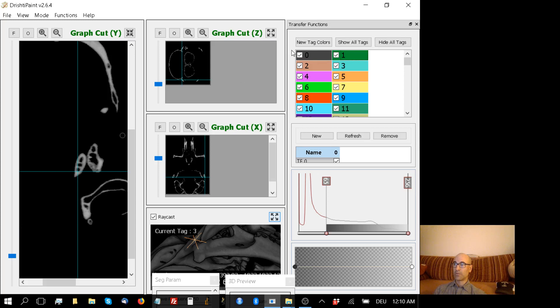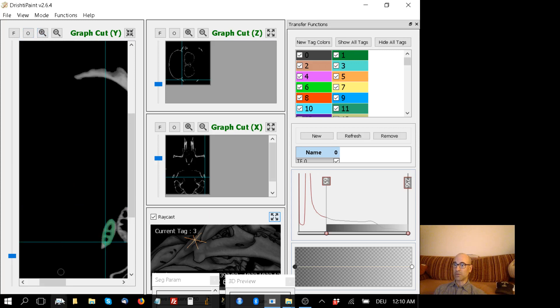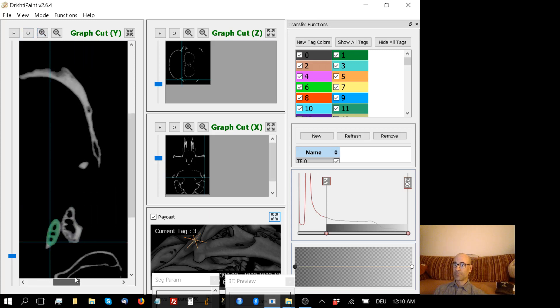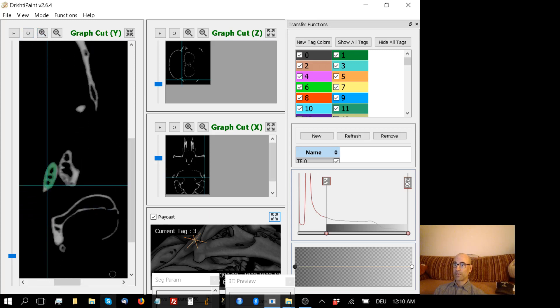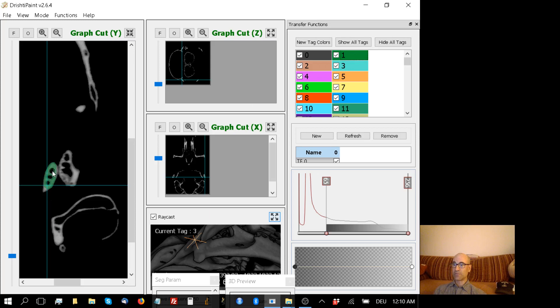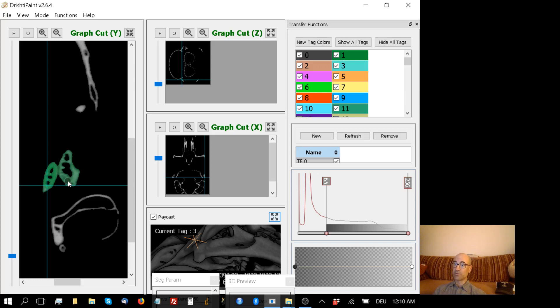I can do that by clicking on tag 1. In the 2D, you don't have to hit shift, you just hold down the left mouse button. You can see there's a bit of a gap there. I'll zoom in a little more. What I can do now is just hit T for tag. After making sure that 1 is clicked and I have some of this initial left mouse applied tag, I hit T, and you see it grew. It grew a little too much, actually, because it got all of this dentary bit. So I want to get rid of that. So I hit R.